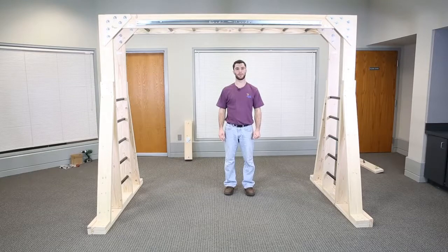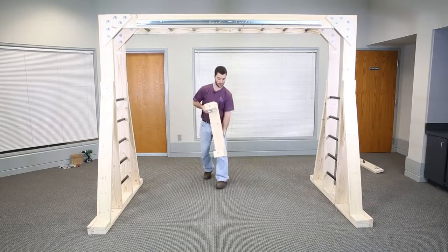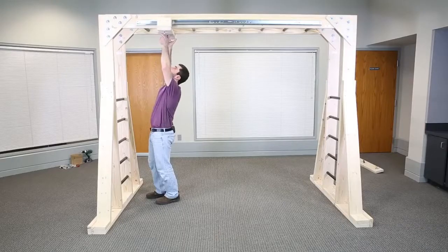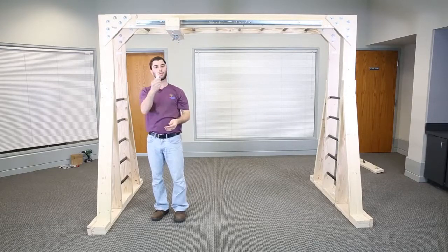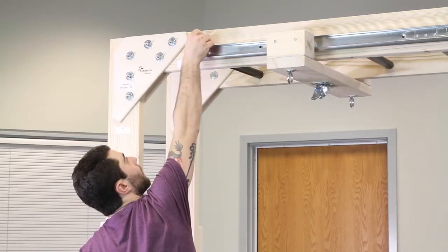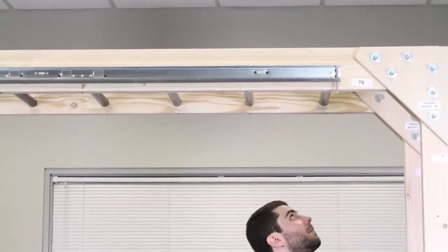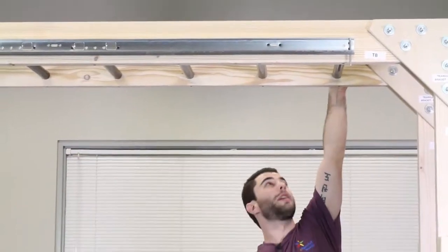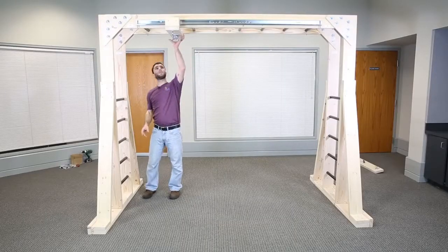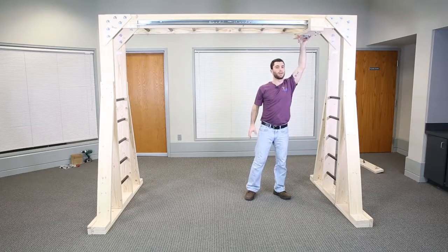So now that the assembly of our indoor therapy gym is complete, you can begin to use some of the attachments that come with it. One of which is our glider. To attach the glider, simply place the wheels on the track on both sides of the gym. And then for safety, inside your hardware pack will be 4 hinge pins. You place 1 hinge pin into each hole at the end of the track. You may want a step ladder for this task. And with the hinge pins in place, your glider is now secure on the track and is free to slide from side to side without fear of going off the track.